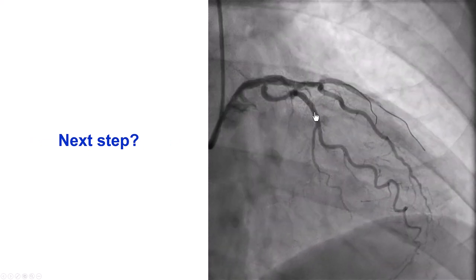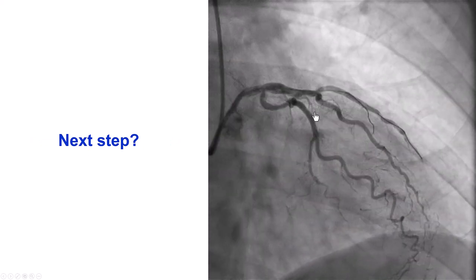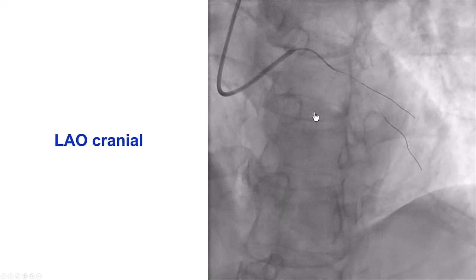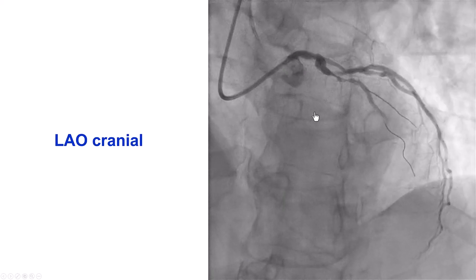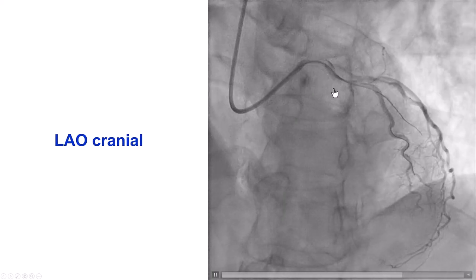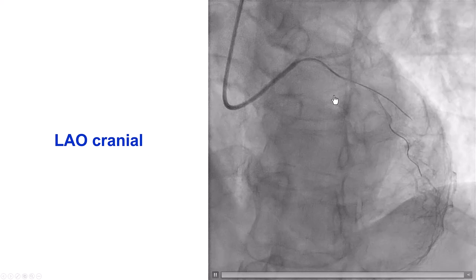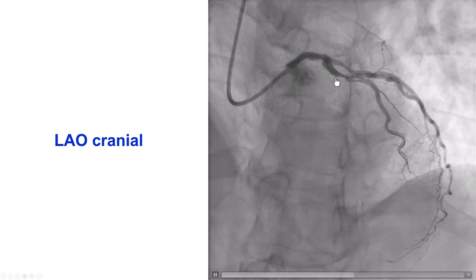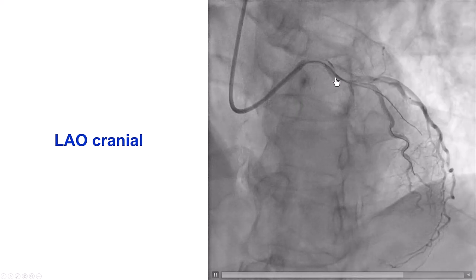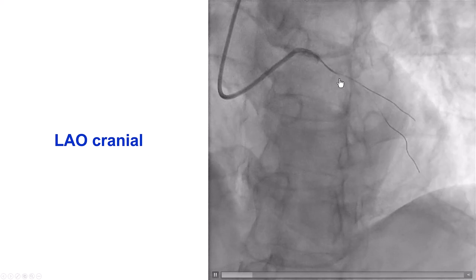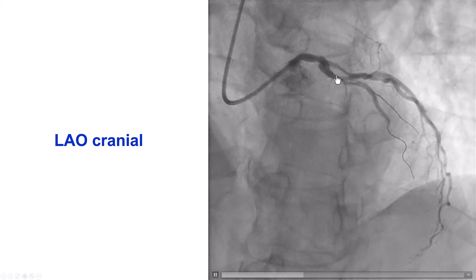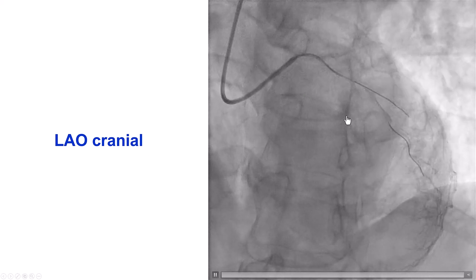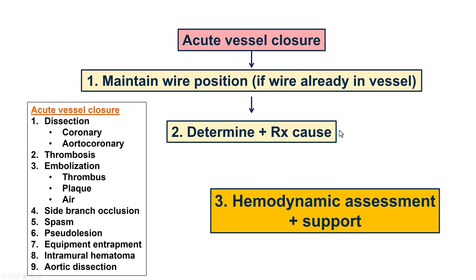While we were trying to wire the LAD, the patient developed chest discomfort and ST segment changes — this is the problem. We have lost flow into the LAD. This is an example of acute vessel closure during attempts to wire the LAD. We do have flow into the diagonal, but the flow into the LAD has stopped.